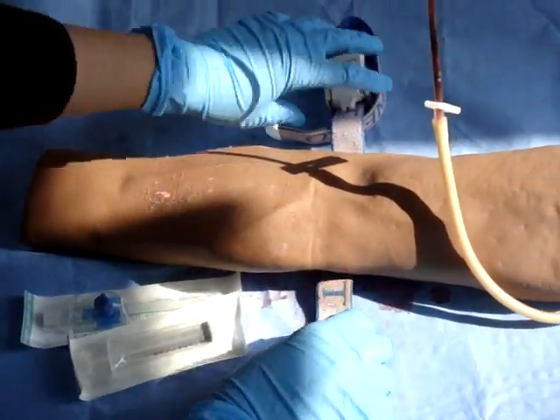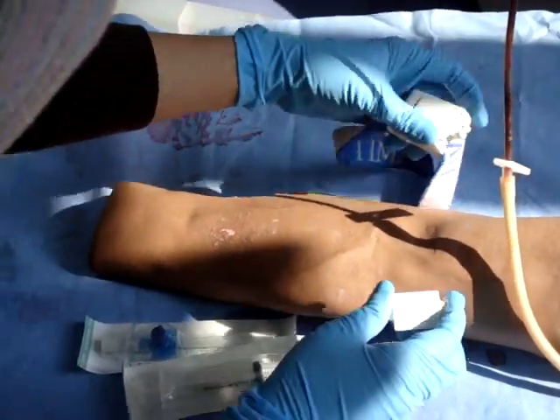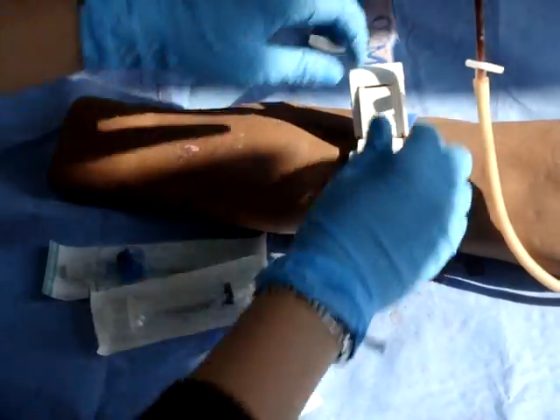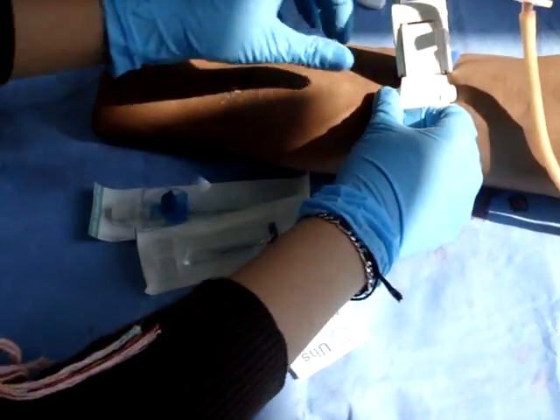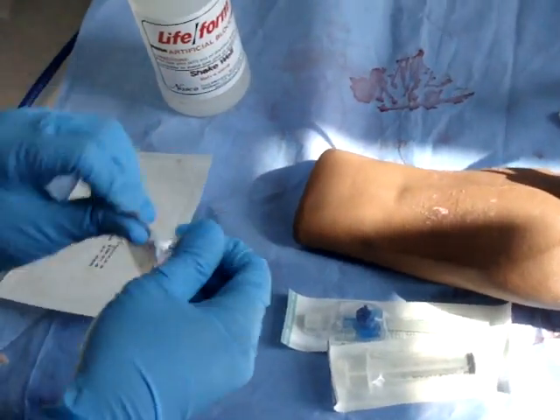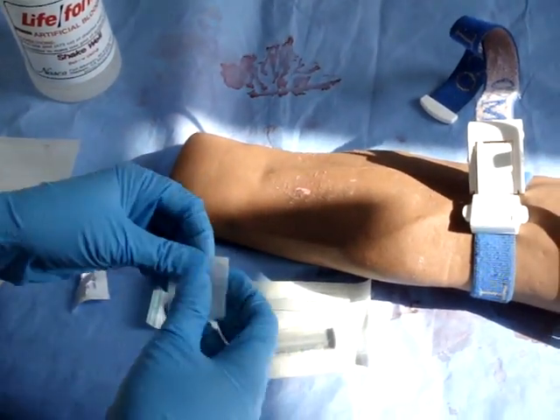First, apply the tourniquet — strap in and tighten. Locate the site of a vein, then get the alcohol swab and swab the site.